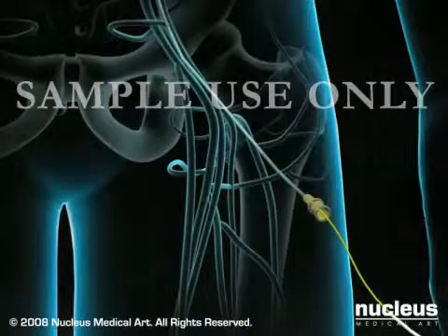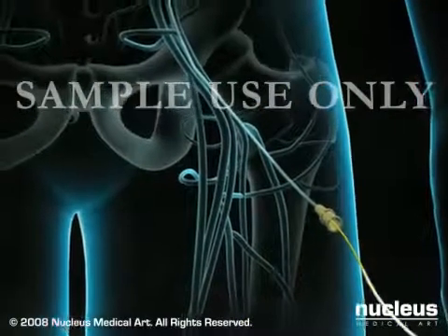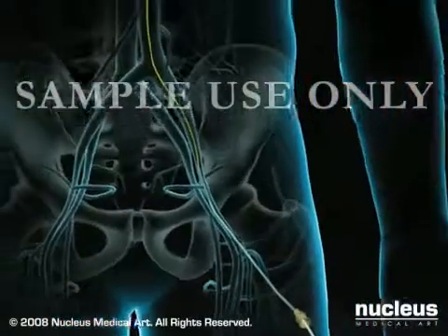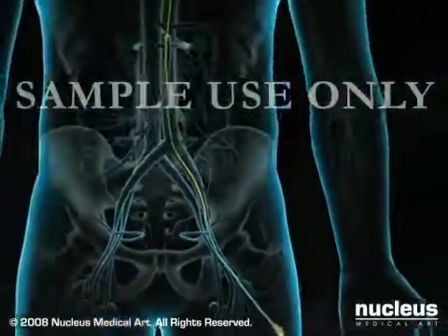Next, a soft, flexible catheter is slipped over the wire and threaded up to the heart. The procedure is monitored using a continuous X-ray imaging device called a fluoroscope.